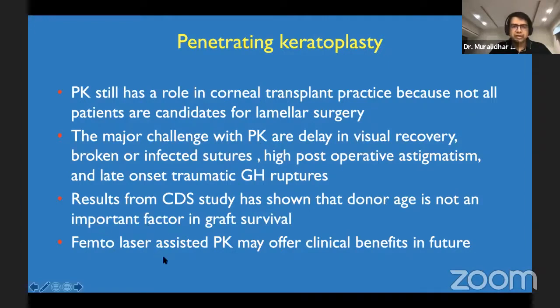As Dr. Fogla pointed out, the femto may actually have immense benefits. Particularly, it helps you in having a precision cut. You can actually tailor your bed to various configurations. So this may actually help in negating the post-operative astigmatism.